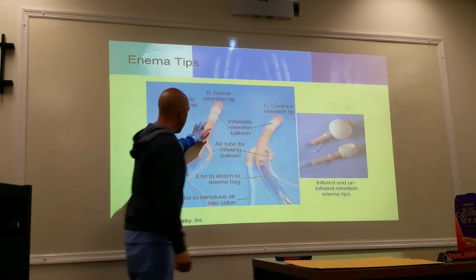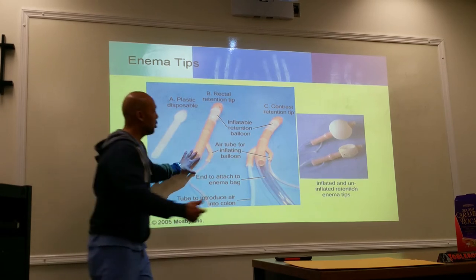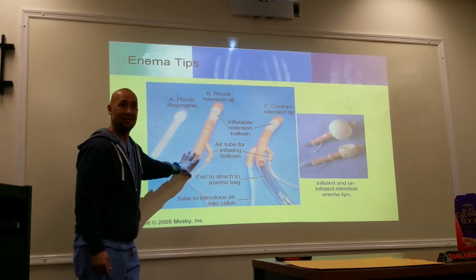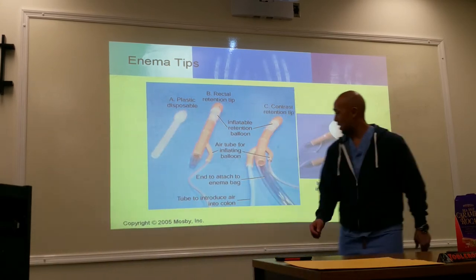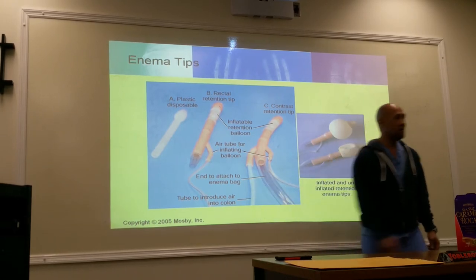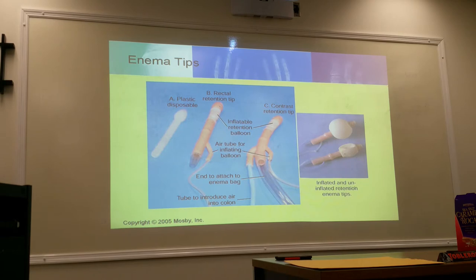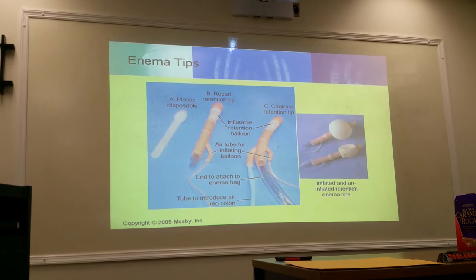So this is good here. When we're looking at this, this is good for single contrast study, because there is no other port or line to allow air to go into the intestine, like you have over here. So now you have two lines. One is for the inflation of the balloon, and the other one now here is another line. This is the third line that allows you to put air into the bowel. Pump it up. Okay?